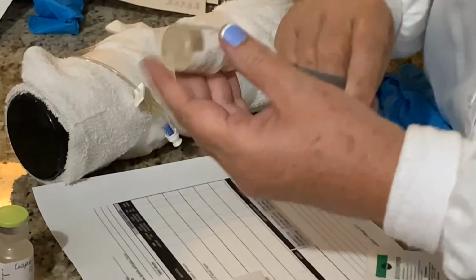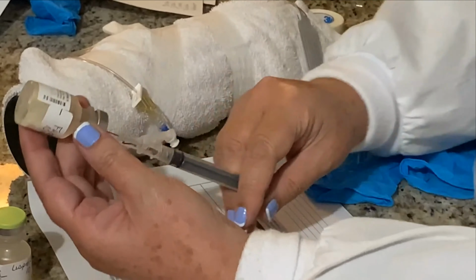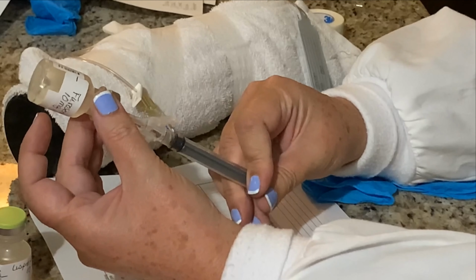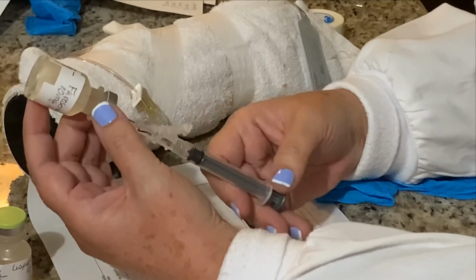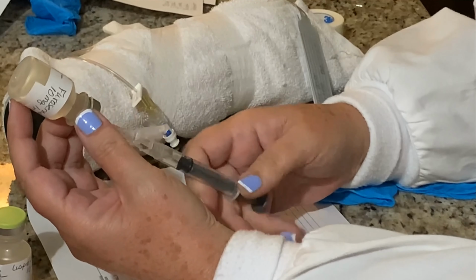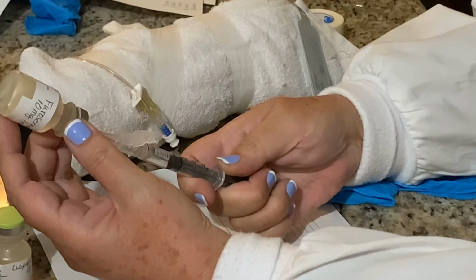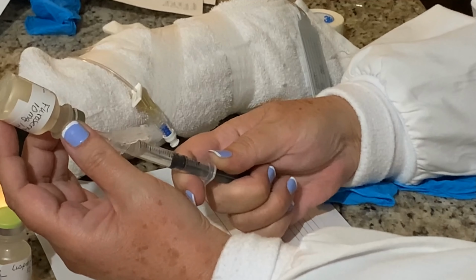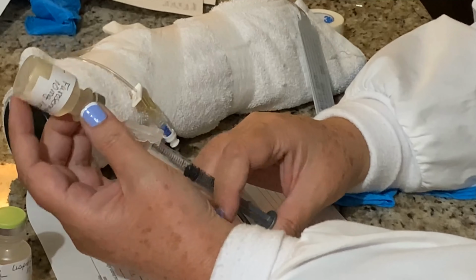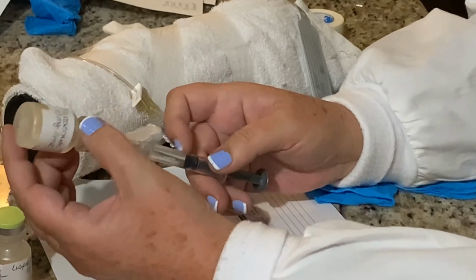Push my air in. I'm going to pull back. Sometimes you'll get air. You can push it back and forth if you need to. Just make sure that your needle is underneath the liquid. Otherwise, you're going to draw up air. You can always draw up more than you need and then push it back up and the air will go in. So I've drawn up 2.5 and I'm pushing up to get the air out. And now I've got 2 mLs.